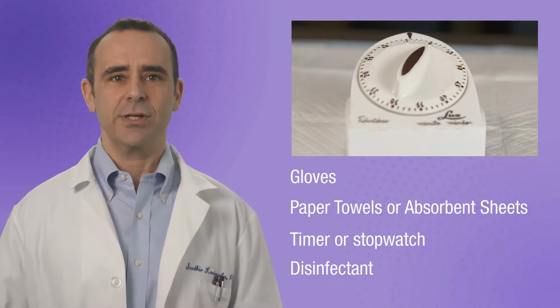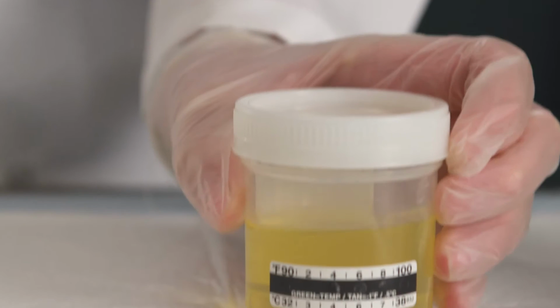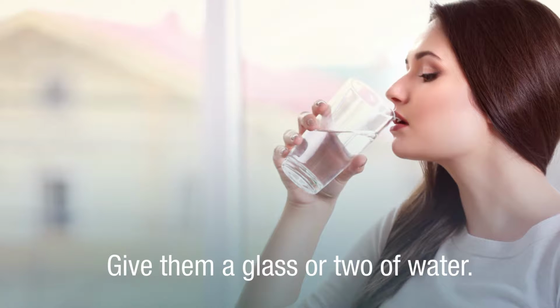So, let's get started. Your participant is here. Hand them a urine cup and instruct them to fill it at least half full or more. If a participant is not able to provide an adequate sample now, you can give them a glass or two of water and let them wait until they feel ready to provide a urine sample. Now, let's proceed with doing the actual test. This is a 6-step process, and we will explain and demonstrate each step.